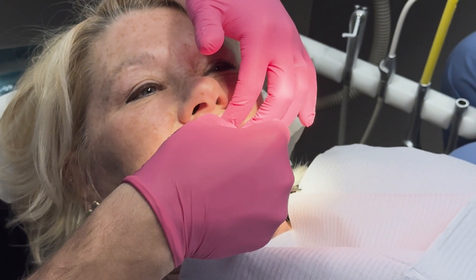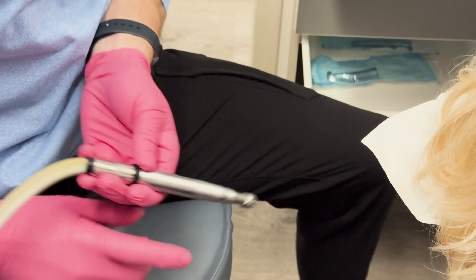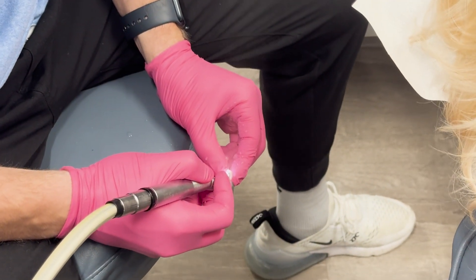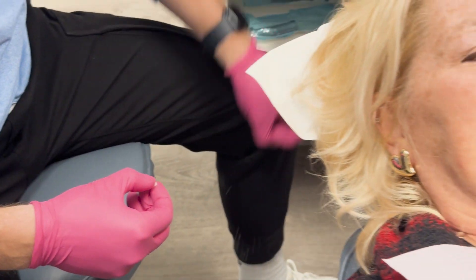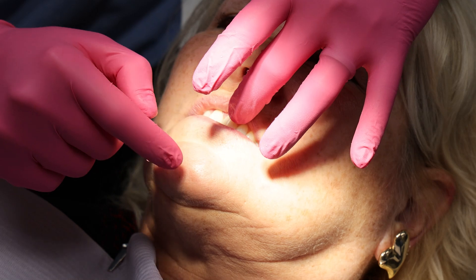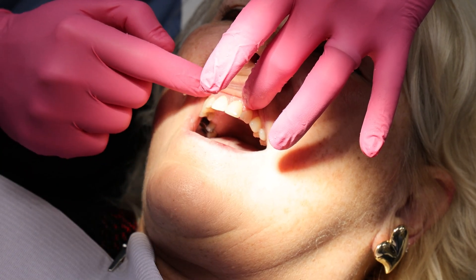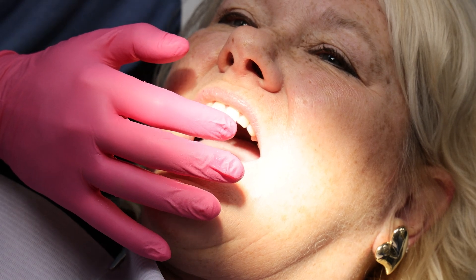Bite and hold it, and open. I can do a little adjustment on the back of that, no problem. Bite again - better, worse, same? Better. So I can always do some more adjustments once they're in, so they don't move around. But if you are happy with the color, shape, and looks of these teeth, we'll have you sign the form to cement them permanently and go from there.